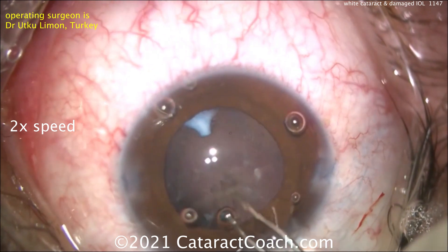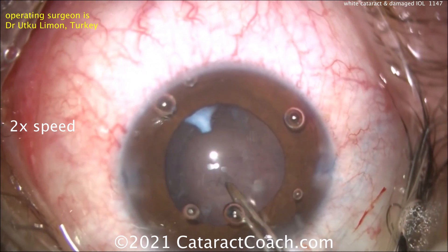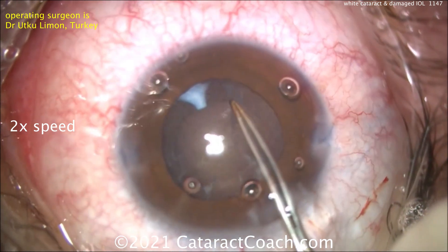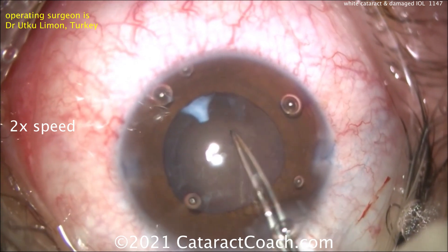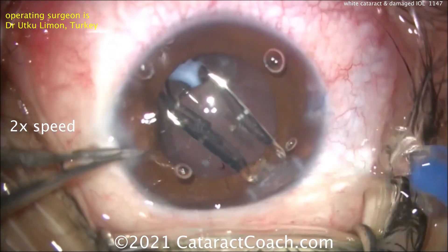Also remember this is a younger patient — only 35 — so the vitreous is more solid and very likely to have an intact anterior hyaloid face with a lot more support, making you much less likely to have vitreous prolapse in this case. So it's okay to make this posterior capsulorhexis, which is a little on the smaller side, and that's completed just nicely.